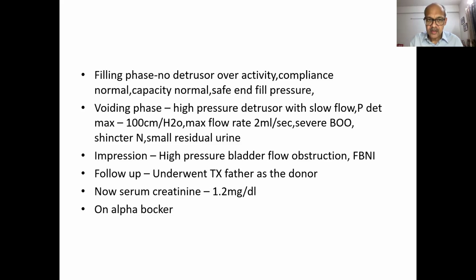So I'm assuming that in this patient, the rest of the presentation matched up. If the patient complains of voiding difficulty, and I think this patient did, that suggests that the obstruction you're seeing is actually a real problem. Or if the patient has elevated residuals with all these findings. So you've got to look at some of the other things, like the lower tract morphology and so on. So if everything fits in, be careful, but if everything fits in, the patient might be having a high pressure obstruction. The terminologies are not very perfect here, but if there's a high pressure obstruction, we would then look at what's the location.